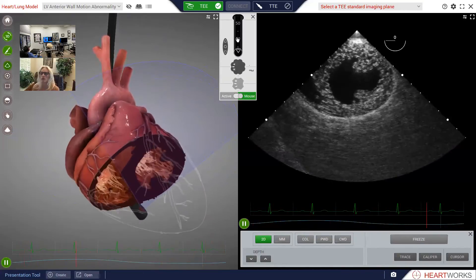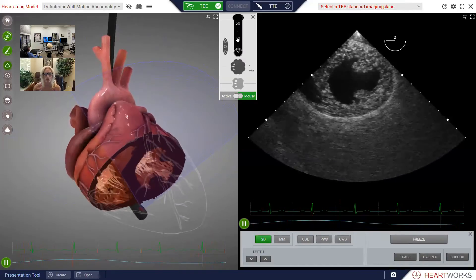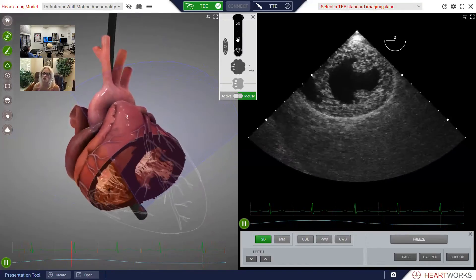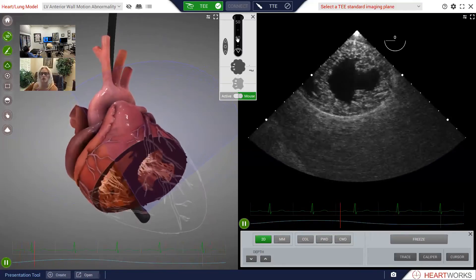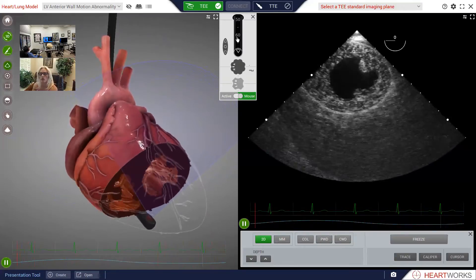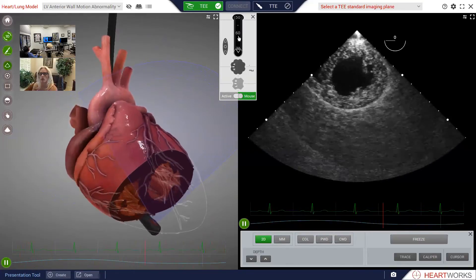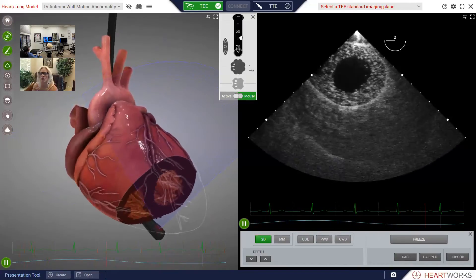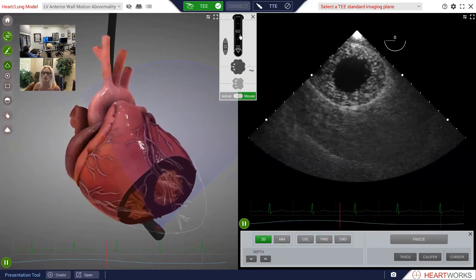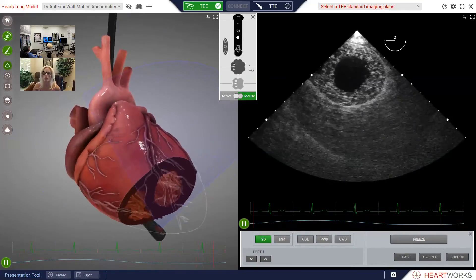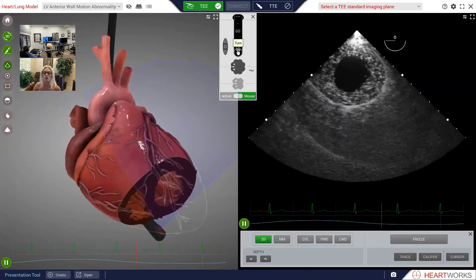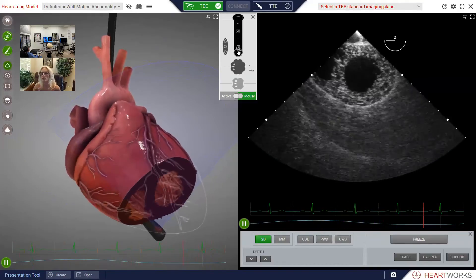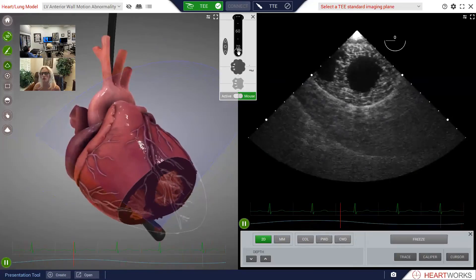Now we're looking at a transgastric mid-papillary short axis view. The view that we want is actually somewhere between this view and a deep transgastric view. So go ahead and carefully push in the probe just a bit further until the papillary muscles almost disappear — maybe about right there. I think that's nice.